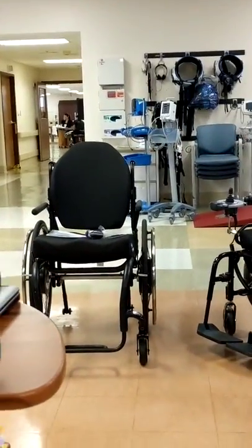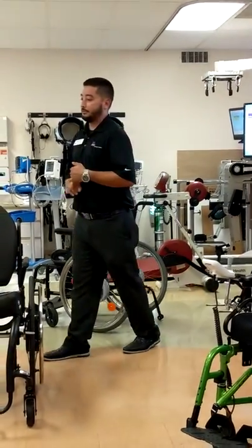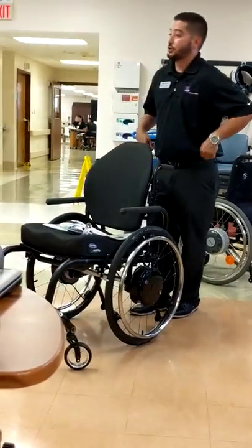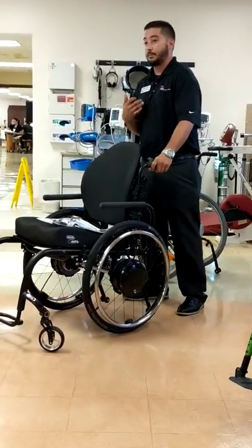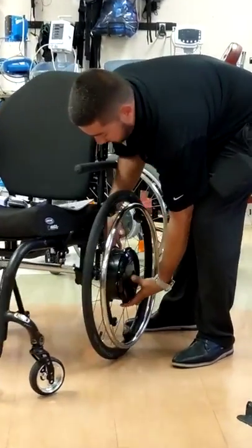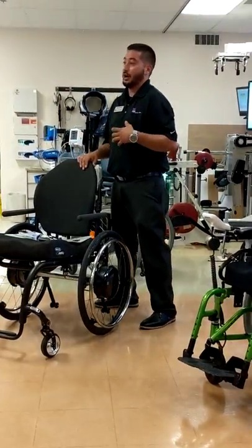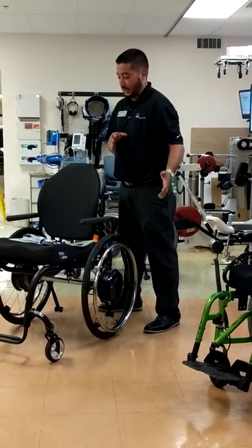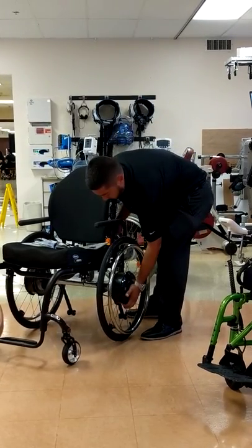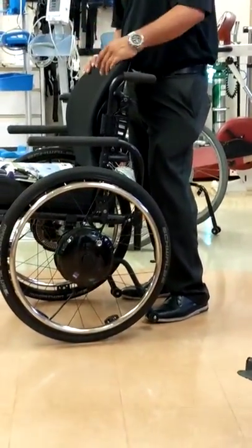This product is Twion. Twion is a power assist — unlike the eFix, where it's joystick-driven, Twion is sensor-driven at the push rims. The push rim has a little bit of play in it, so you give a push and the motors pick up and assist you in that motion. Just like the eFix, we add a bracket to the chair and add the wheel. You can remove the Twion wheels and put your standard wheels back on — the motor and everything is in the wheel itself, so when you remove the wheels, you remove the Twion. There's no other battery packs to remove.